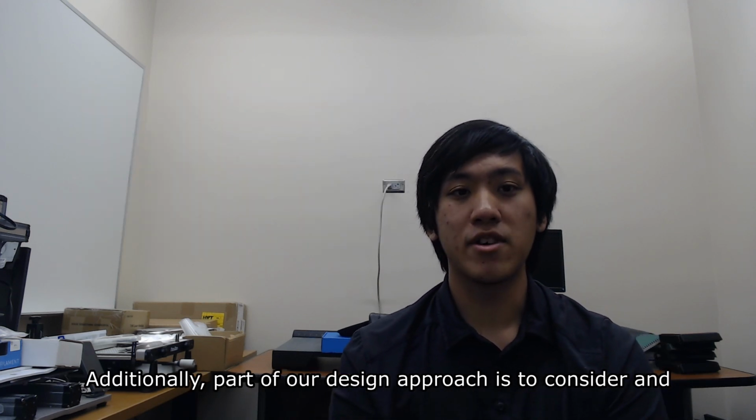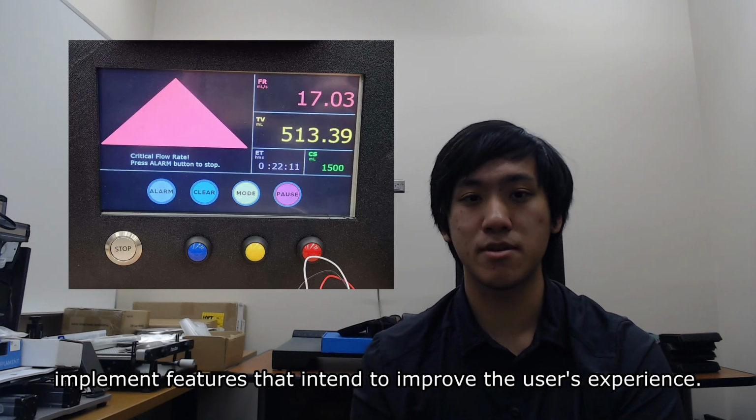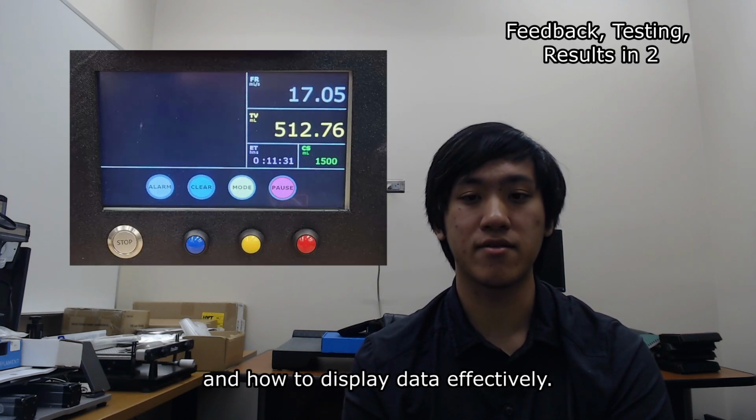Additionally, part of our design approach is to consider and implement features that intend to improve the user's experience. These include designing the functionalities of certain buttons, how to implement user input, and how to display data effectively.